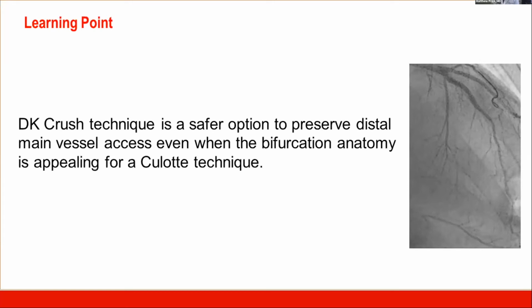So Milad, we have a couple of questions, which I will ask Richard, and maybe Tanvir can get on as well. Okay, so first is, and I think you did address this a little bit, Milad, but why not use a microcatheter to wire that side branch of the aneurysmal segment rather than using an angioplasty balloon to modify the plaque? I gather the patient was beginning to become unstable, so he just wanted to address the main lesion at first. But certainly you could use an angled microcatheter. Would be nice. So was there any thought of using an angled microcatheter to begin with to wire?